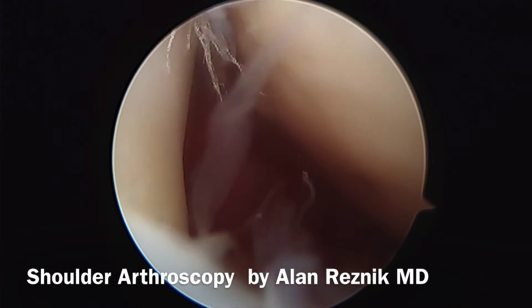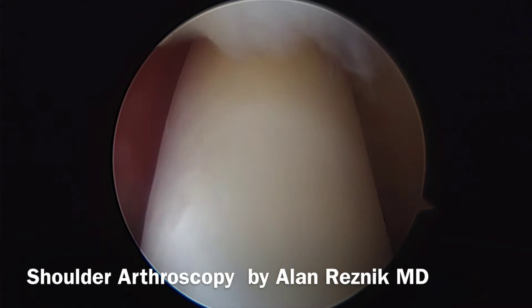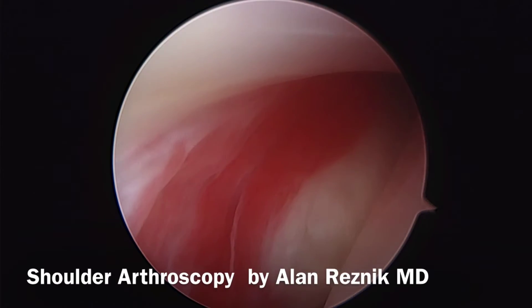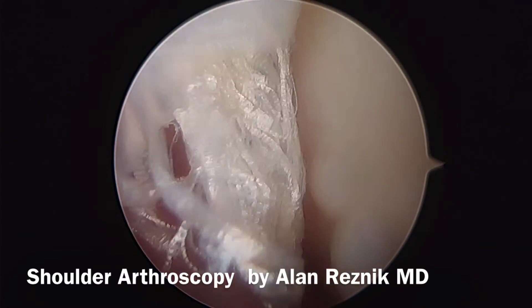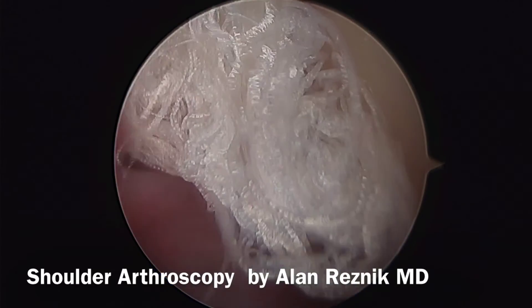Now we're going to follow the biceps tendon and work our way up towards the bicep for the exit from the shoulder. You can see inflammation around that, but the tendon itself is not torn — there's inflammation in the rotator interval. And then we see a little bit of a partial subscapularis tear there at the edge.